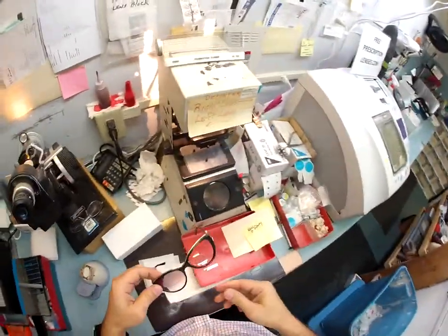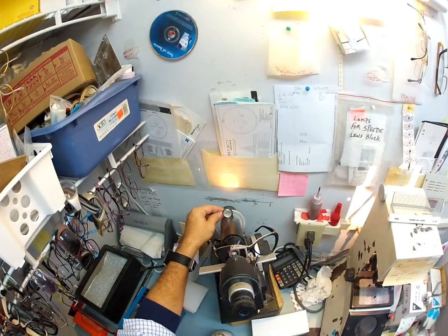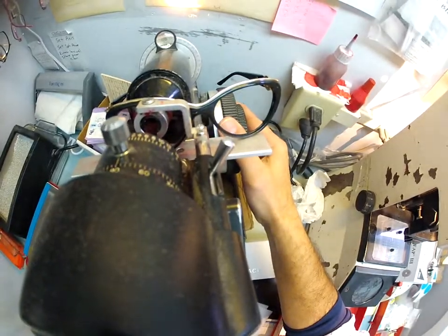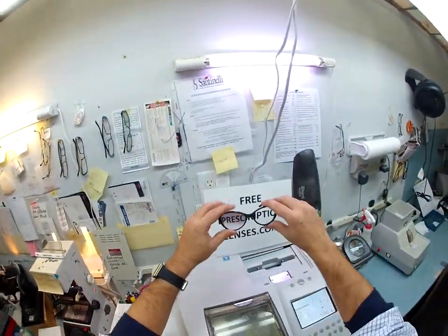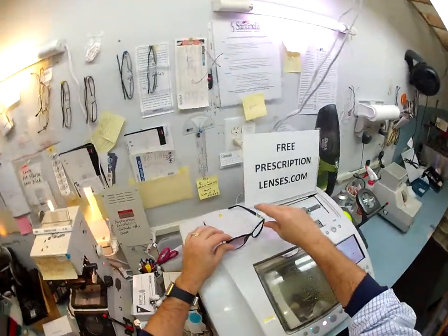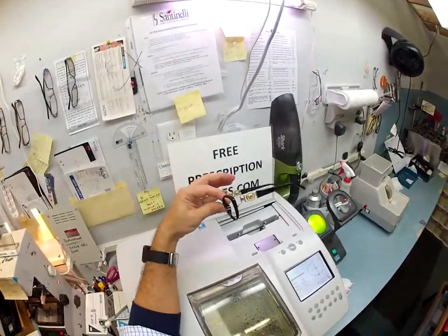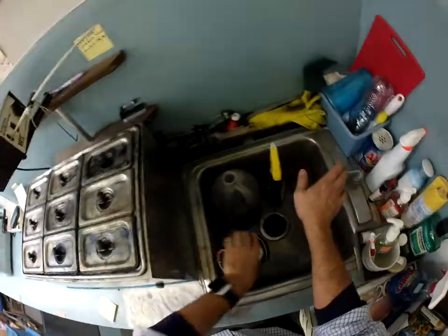I put this into my Marco 101 lensometer, spin the axis wheel to 105, then spin the power drum to the sphere — it comes in correctly at minus 75. I spin an additional diopter to check the astigmatism correction and the cross curve, and that checks out perfect. You can see the gradient tint — this side is clear, this one has the tint because you mentioned you are light sensitive. Twenty dollars worth of tint for you. Years from now when you need new prescription lenses, I can mail you just the lenses and you can mount them into the frame yourself.